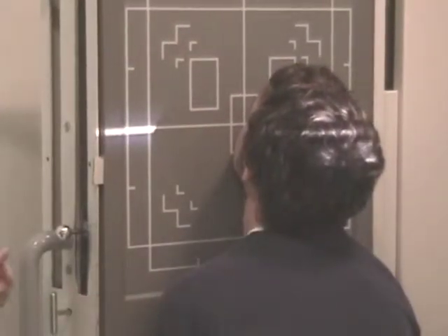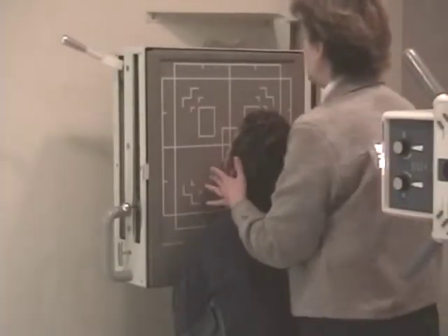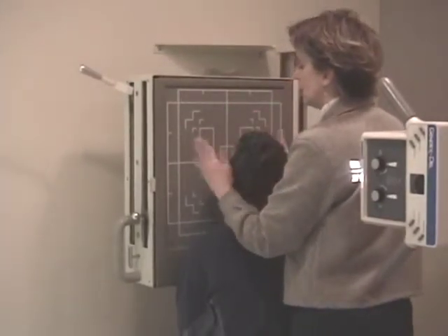And you line things back up. I will now look at the MSP, make sure it's centered and perpendicular. And I can look at the nose coming down this line. And then I'm going to look at his orbits to make sure they're equal.